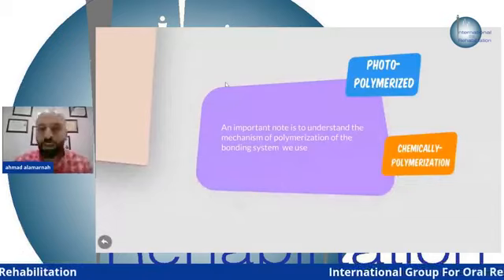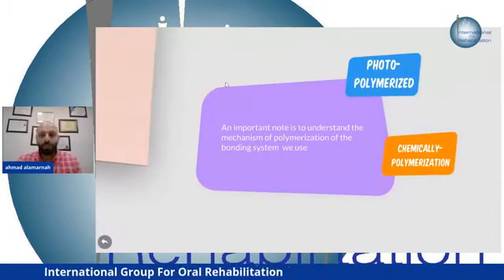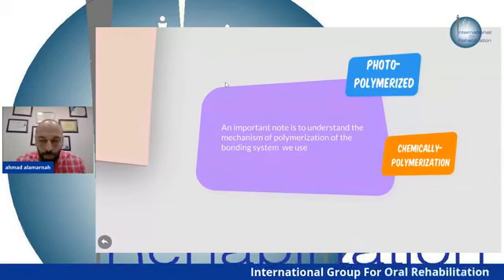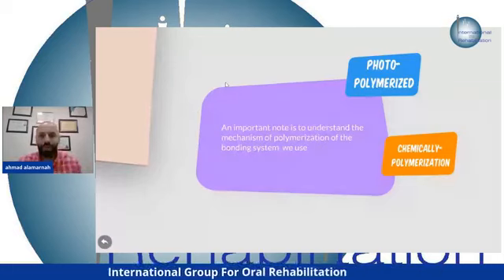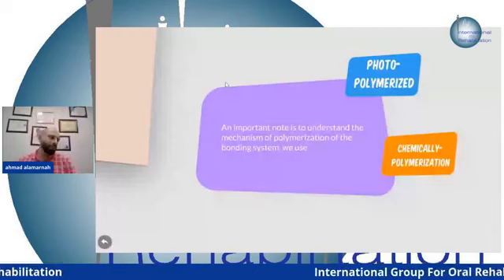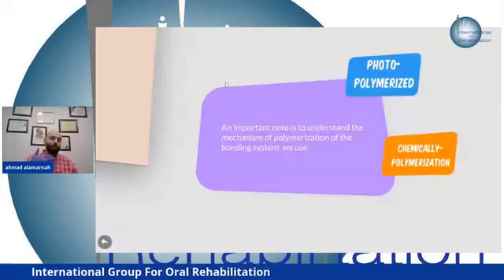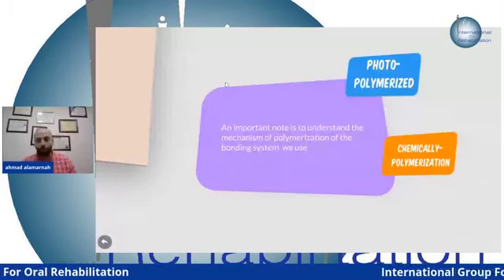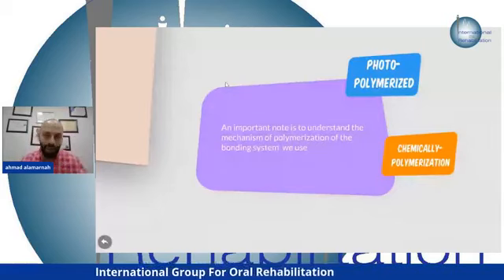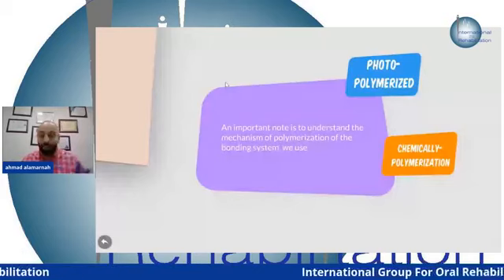After that, let's say something about the polymerization. We use our composite and bonding system, but we have to know some of the reaction. What's the type of reaction? There's photopolymerization and chemical polymerization. What's the meaning of photopolymerization? It's the use of light cure to polymerize the composite. And the chemical one will polymerize or react without the use of the light cure.